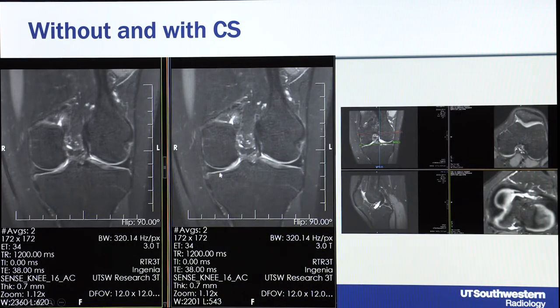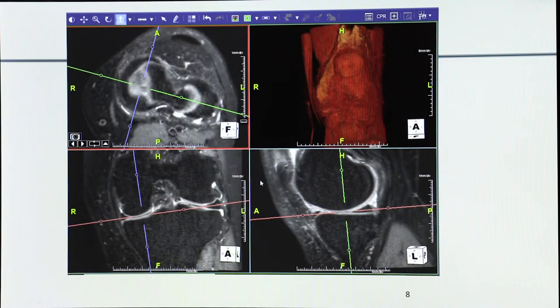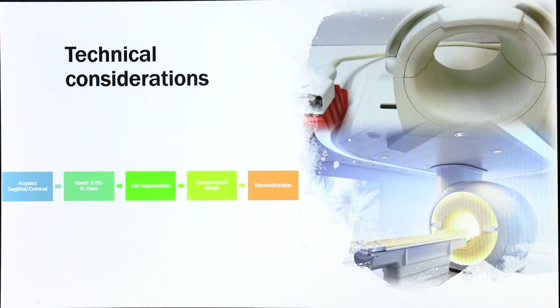There is also a compressed sense variant from one of our Philips scanners. Comparing without and with compressed sense, there is about 40% time reduction with very similar resolution. Once these images are acquired, they can be reconstructed in all three planes. Here I'm reconstructing along the medial meniscus and now you can see the whole medial meniscus on the axial image — exactly what you wanted to see.